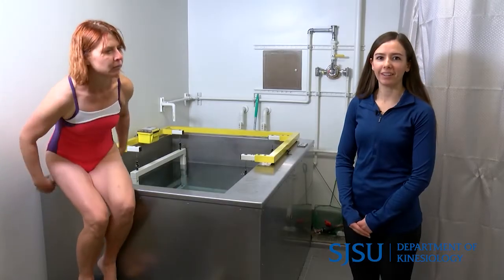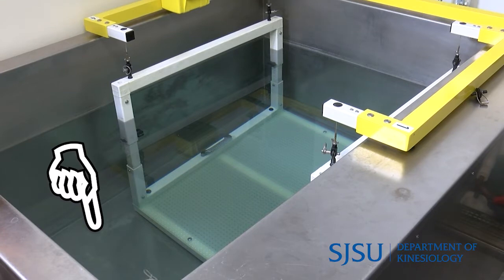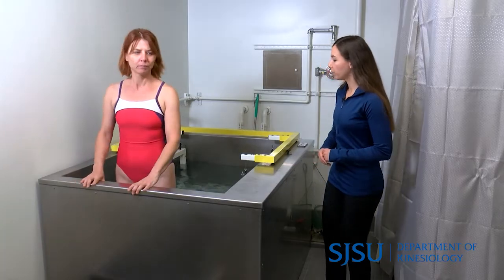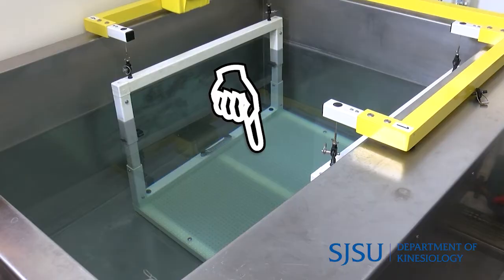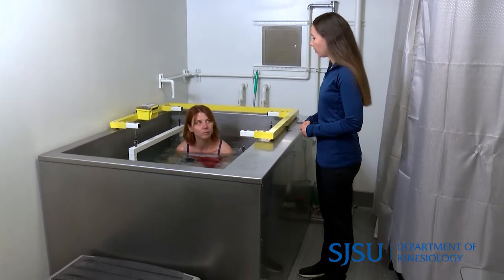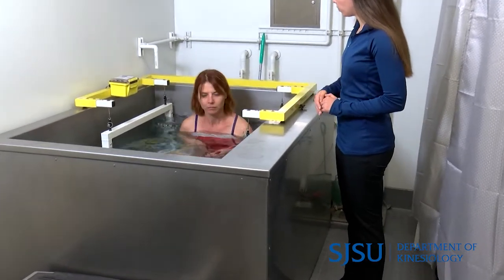Now we are ready to get started. I'm going to ask Alev to swing her legs over and step directly down on the metal floor. Now that you're in, I'd like you to face the door and slowly lower your bottom down onto the platform — just go ahead and sit down. Sit with your legs crossed, pat all the bubbles out of your swimsuit, and get your hair wet as well.